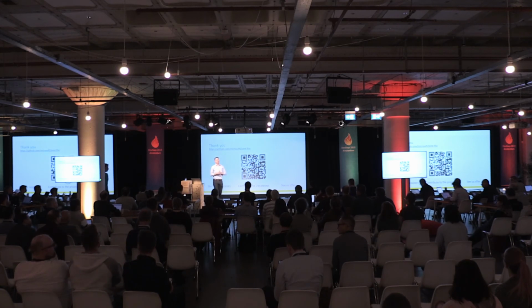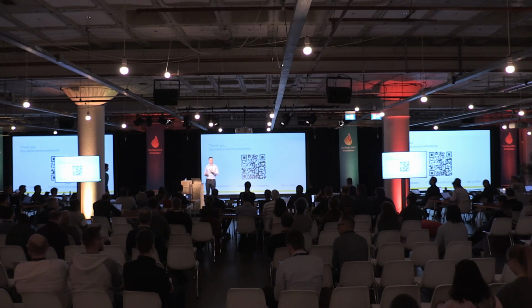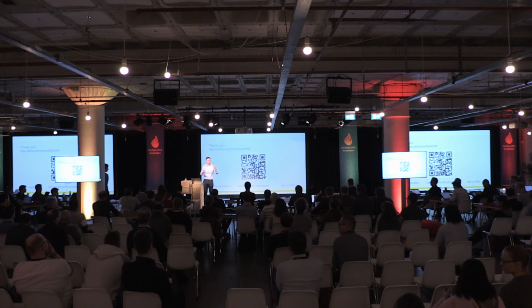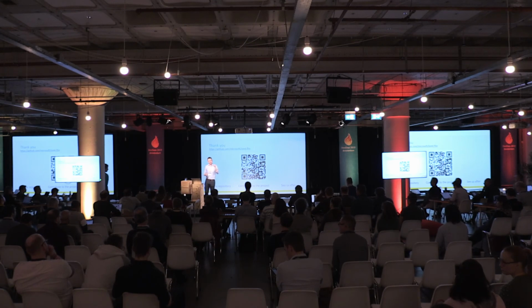Sure. So the question was how the buckets work, and that's really more about how you evaluate the value sample data type. If you think back to the value sample data type, there's the string of values. What I left off there, which is part of the observation, is the effective period. We're giving a period, in this case an hour, with the start and the end. And then the sample data type itself has a period. So you start with value 1 or index 0, and that's time 0 within the offset of the start of the period. And you just increment the period from that forward, so that slots your values.